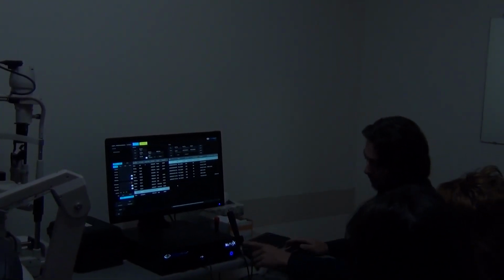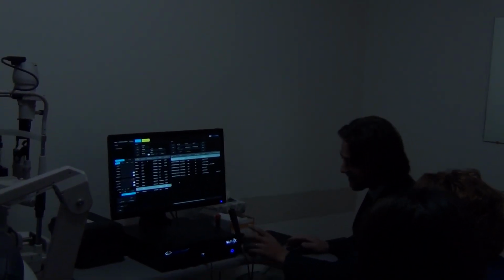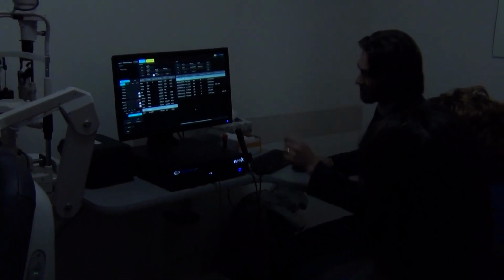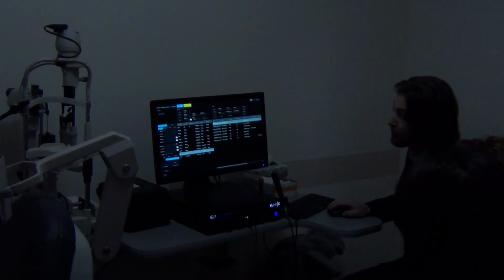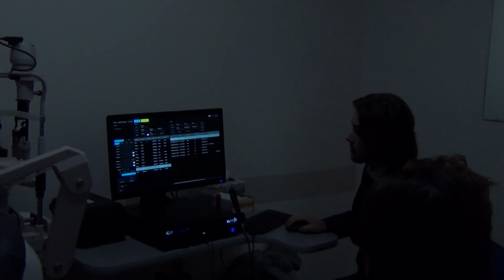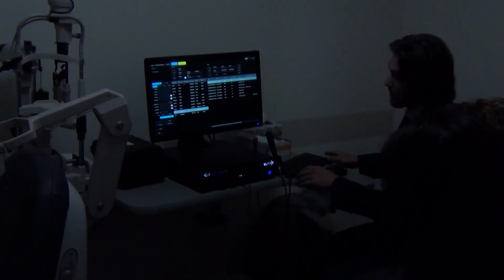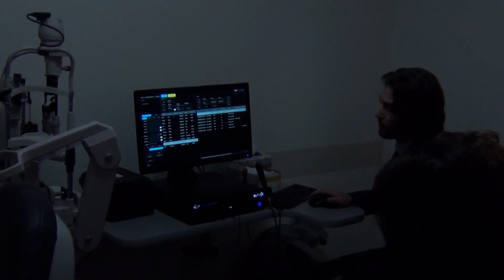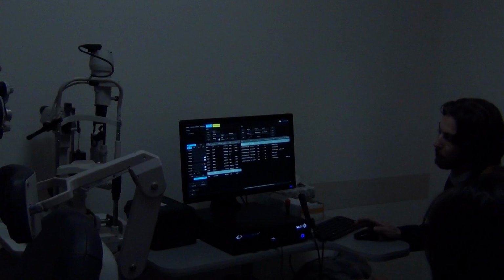All right, well, the easy part is you just use this blue button, right? Okay, I can do that. You press this button, you'll get to the screen with the software. So basically, what do you see here on the main database screen, right? You see the patient highlighted in blue, which means right now you can review your patient's data by patient.